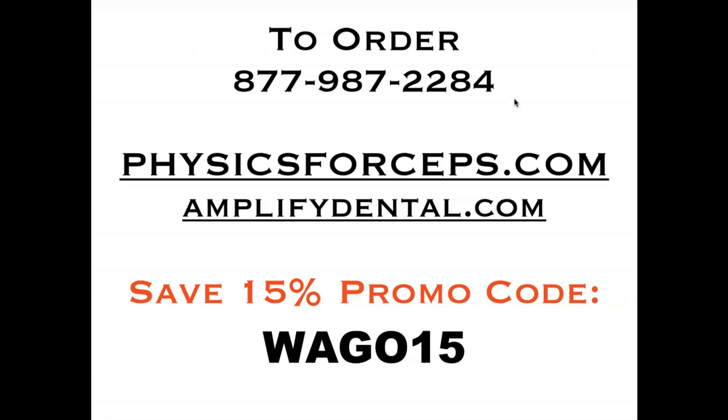Okay. What type of bonding agent do you use with the Wagle fill system? You can use any bonding agent that you're pleased with. You can use it with fourth generation, fifth generation, seventh generation. I'm still a fifth generation guy, so I like the Optibond Solo Plus. But it can be used with any bonding agent.